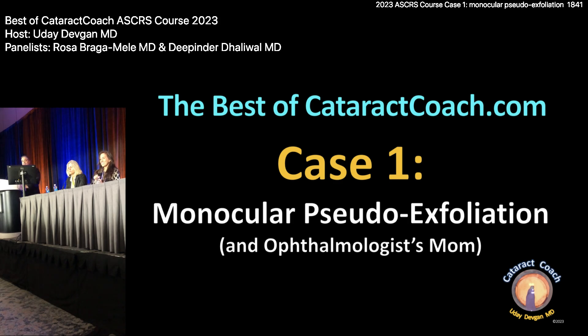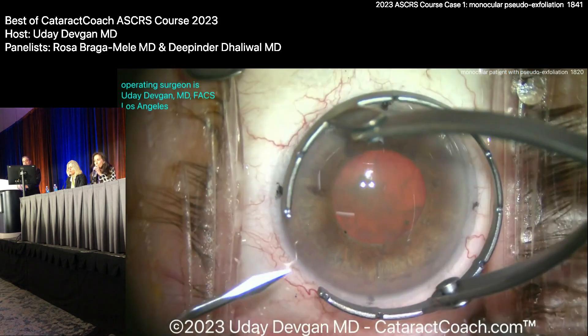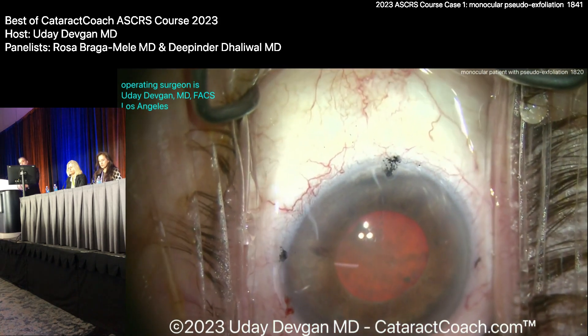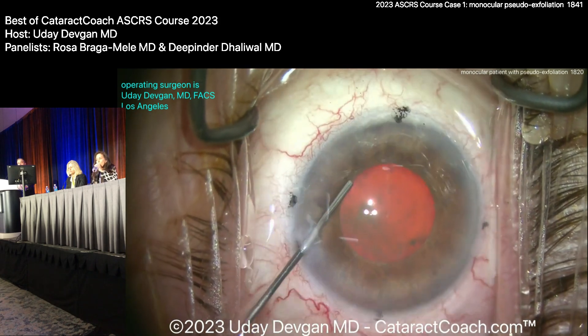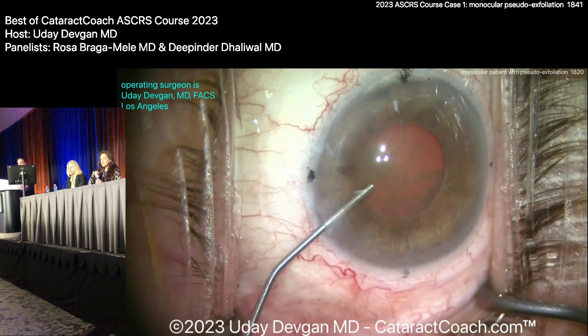Here's the first case — super tough. Monocular pseudoexfoliation. Yes, monocular. No joke. There's the pre-op. Luckily this side has a normal-looking optic nerve. I'm starting the case here and that's the max pupil side. The patient jumps around a little bit. A toric lens is going to address about two diopters of corneal astigmatism — a T5 toric lens. Very powerful patient too.